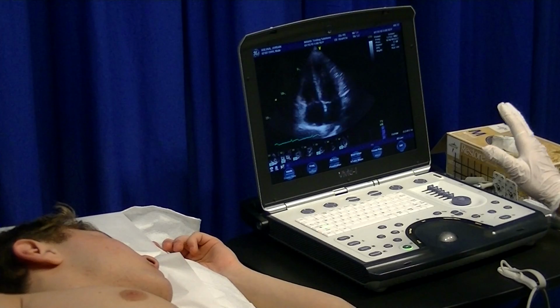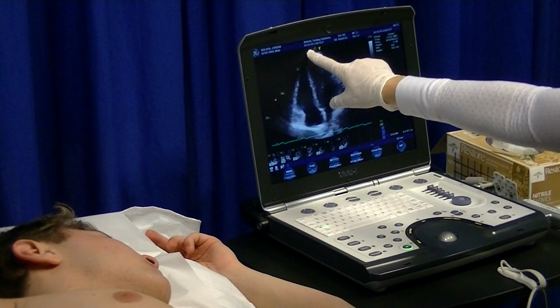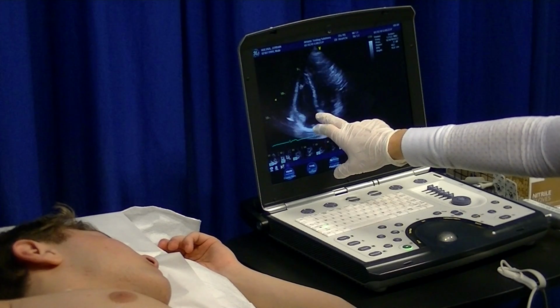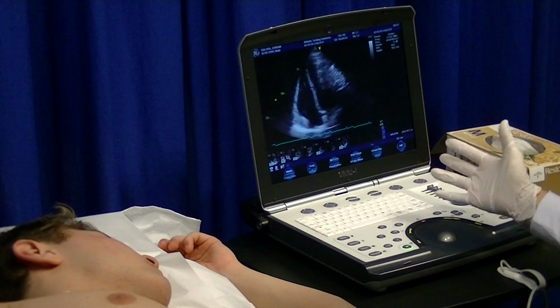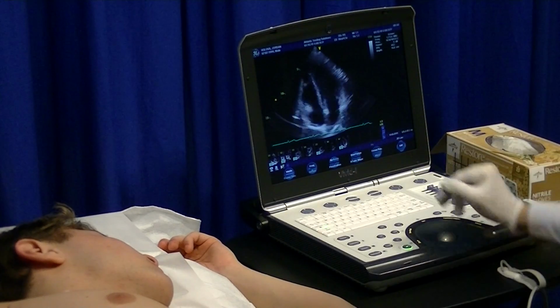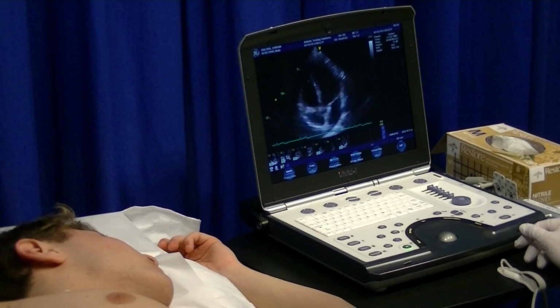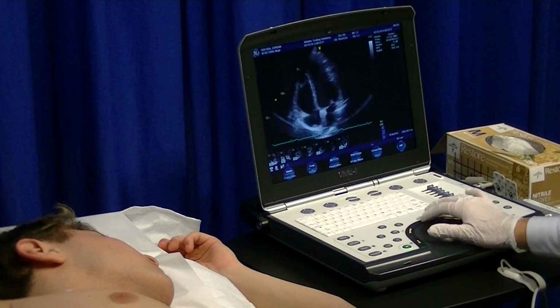So as I'm in this apical 4 chamber, I am doing my segmental approach to heart disease. I am going through making sure that I eyeball each septum, each valve, look at the valve positions. You want to make sure that your tricuspid valve position is just below mitral so you don't have an Epstein's anomaly. I compare chamber sizes to each other. Right should be slightly smaller than left, as well as atria. And just look for any other possible abnormality that's there, as well as wall thickening for hypertrophic heart. So make sure you are scanning your picture quite quickly, but quick scan here.